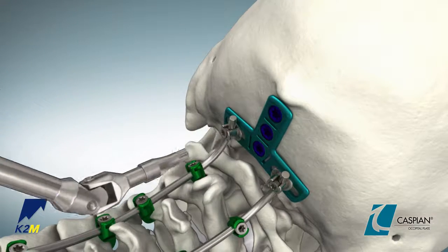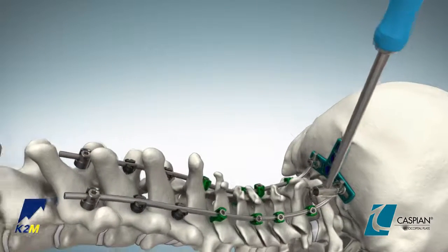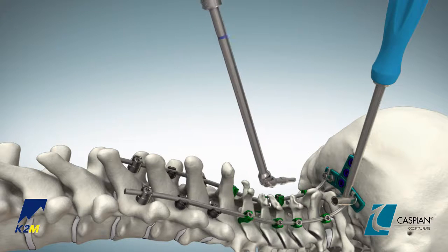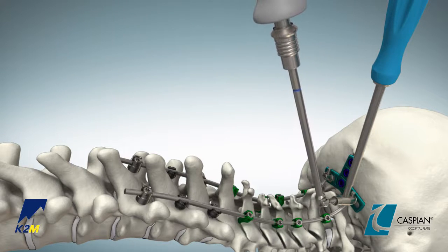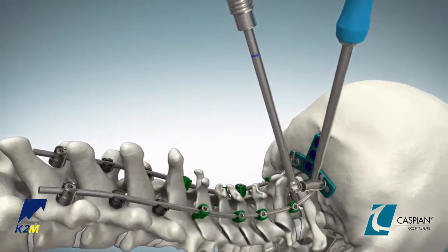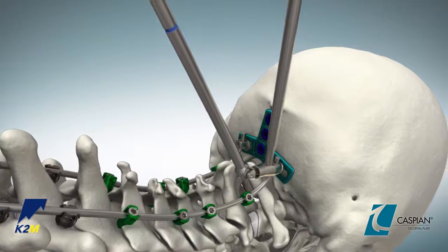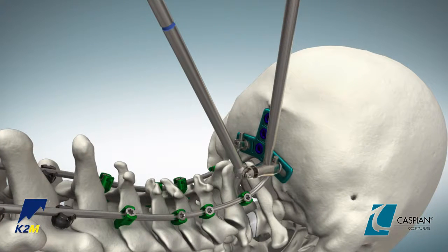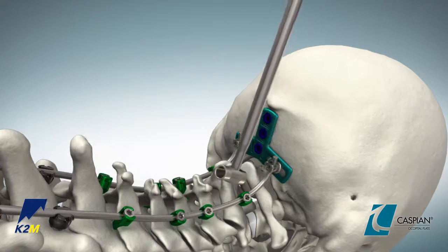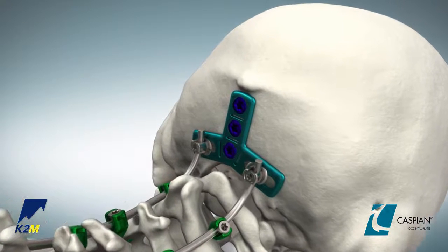Next, place the occipital anti-torque guide around each of the lateral adjustable screw heads. With the size 15 non-tapered screwdriver or universal joint screwdriver attached to the gray torque limiting handle, final tighten the set screws to 2 newton meters or 17.7 inch pounds through the anti-torque guide. This handle will also emit an audible click when the necessary torque has been achieved. Once fully tightened, the screw heads will be fixed in position and will no longer slide along the plate.